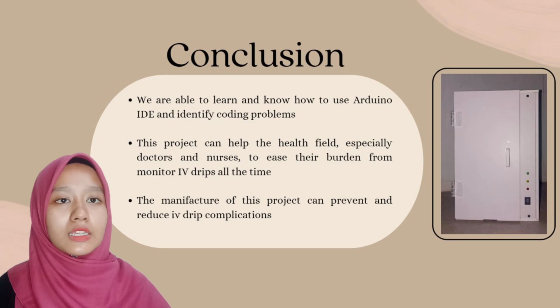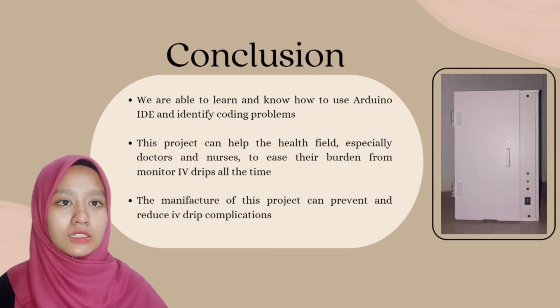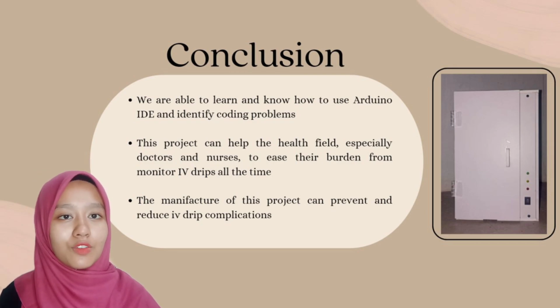In addition, it can reduce treatment costs, which are more expensive than regular treatment. Time can also be deducted from recovery treatment. Last but not least, the cost of making this project is very reasonable and cheap. So with that, we hope that this project can be developed and updated for future improvement so that it becomes a medical tool that can be used for hospital and clinic use.